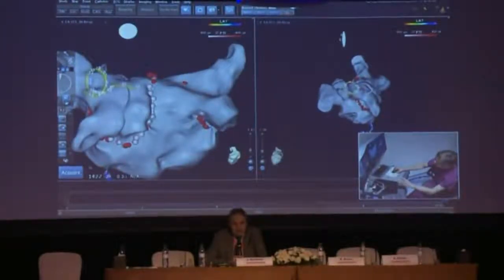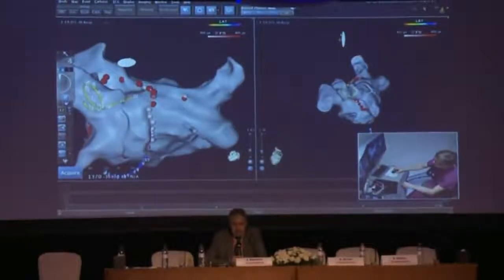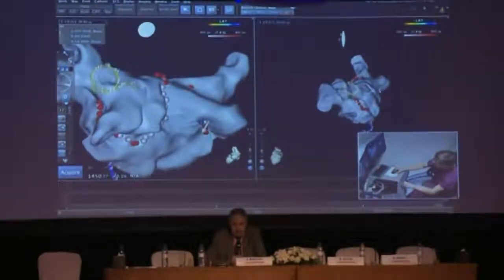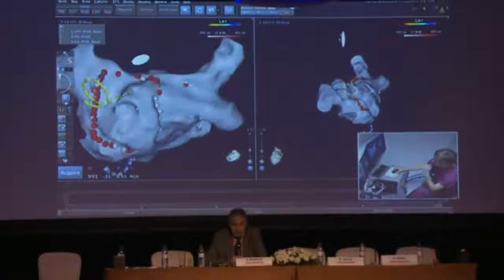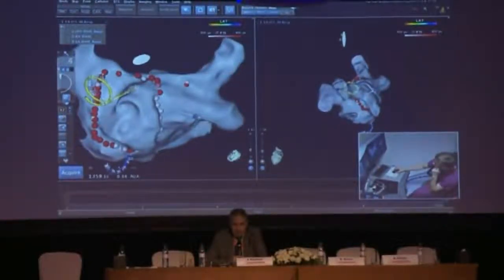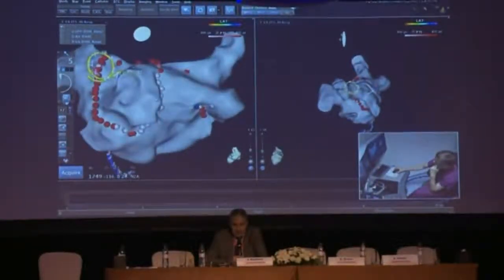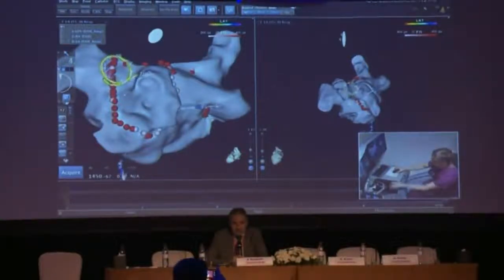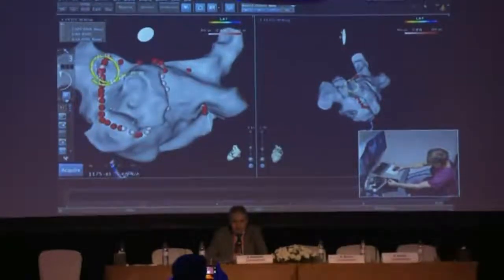And I deliberately set this up so that I can put low force time integrals on the back wall, but then on the anterior wall and roof, I can put higher force time integrals. And I've gone round the left pulmonary veins, but I've deliberately left some gaps because I didn't want to isolate it quite yet. So I've left some gaps up here, but I suspect that even once I've closed off those gaps, the breakthrough, as it almost always is, will still be on this side here, because this lesion set that I've done here is on the appendage side of the vein.